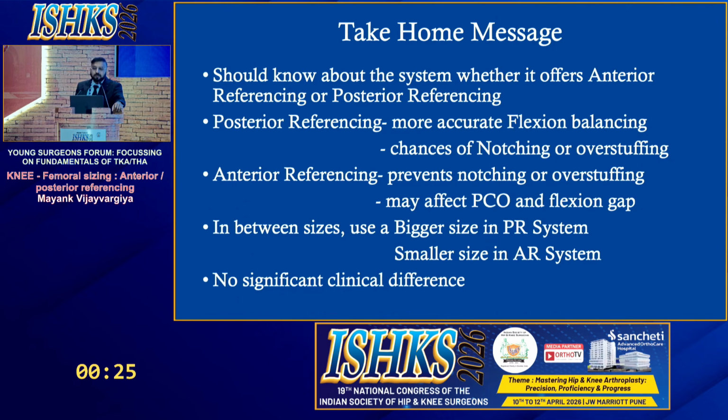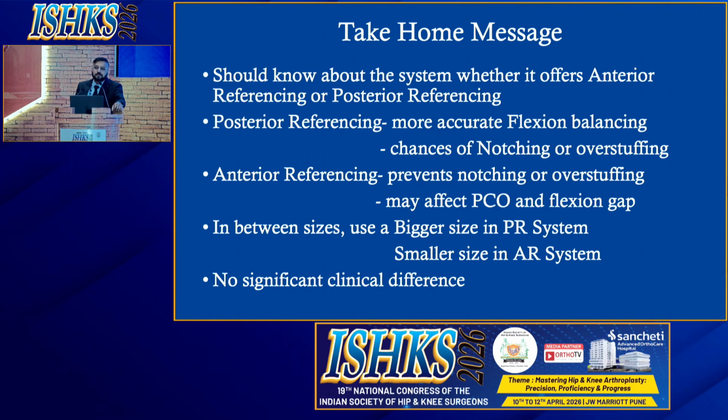So to conclude, my friends, one should know which system they are using. If you are using a posterior referencing system, it does give you more accurate flexion balancing. However, there are chances of notching or overstuffing. You can avoid these if you are using an anterior referencing system, but it does affect your posterior condylar offset and flexion gap balancing. If you are in between sizes, use a bigger size in posterior referencing system or a smaller size in anterior referencing system. Clinically, there was no difference found in between the two systems.